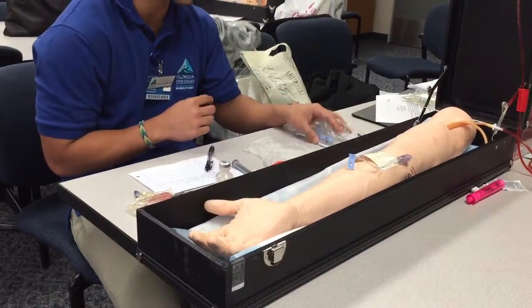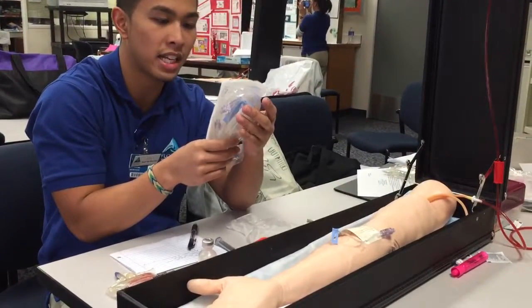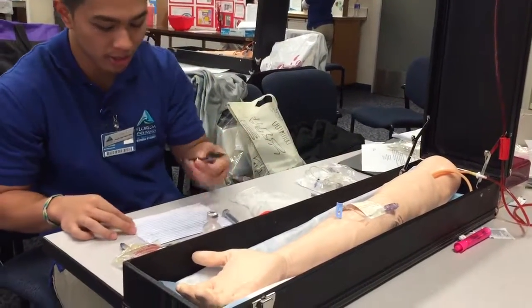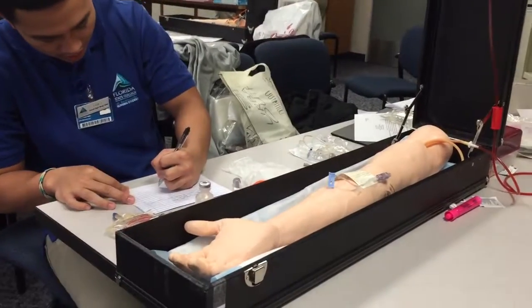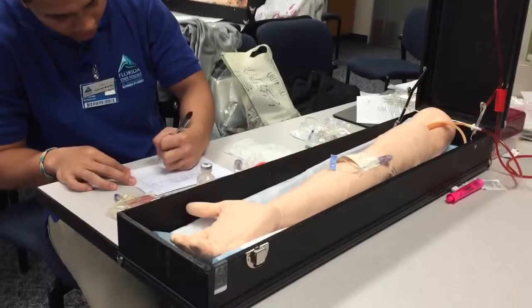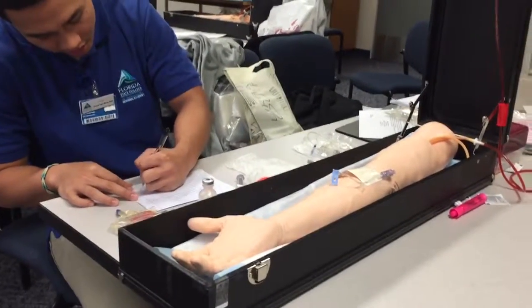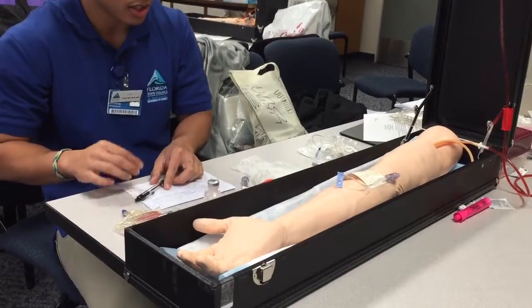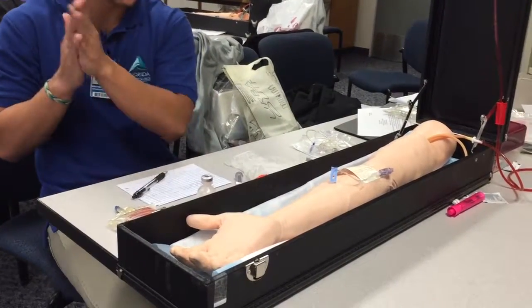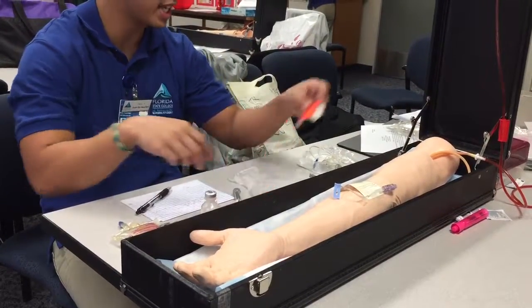And I'm also going to calculate the drip rate, which is right here. Looking at the package, it is 10 drops per milliliter. That's the approximate. It's a 100 milliliter mini bag, and we're going to go over 60 minutes times the drip factor of 10. That gives us about 17 drops per minute. So that's good there. I'm going to go ahead and wash my hands. Wash that, we're good. So now we're going to go ahead and draw up the medication.